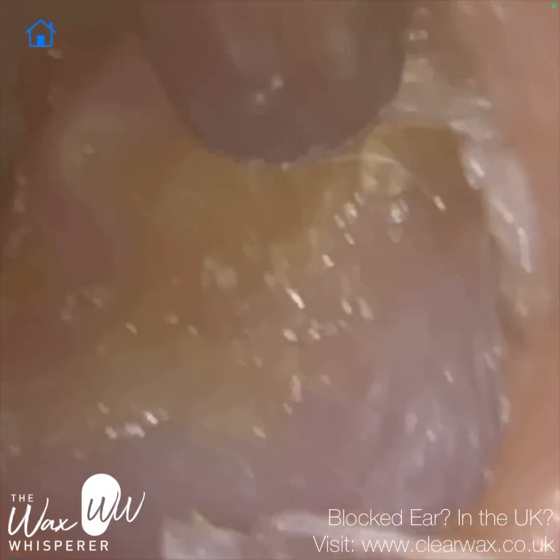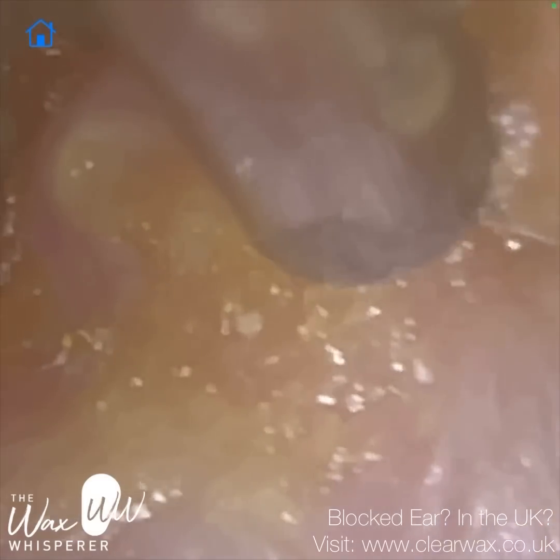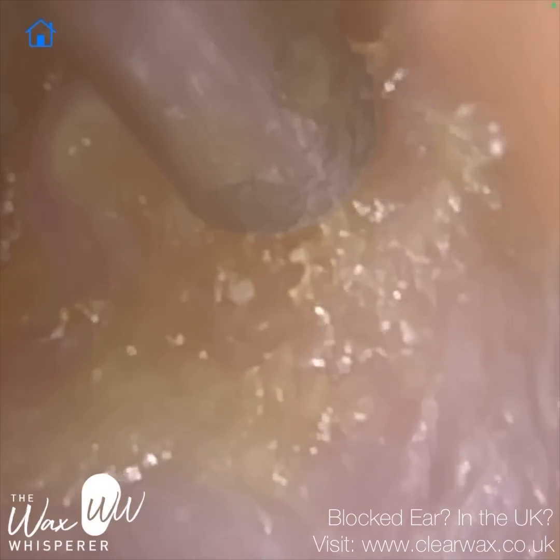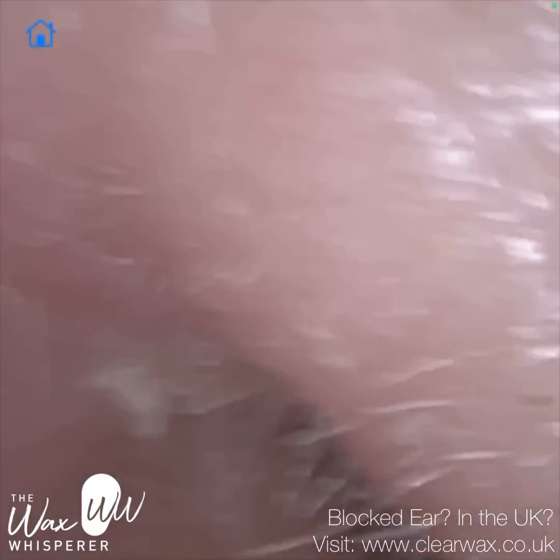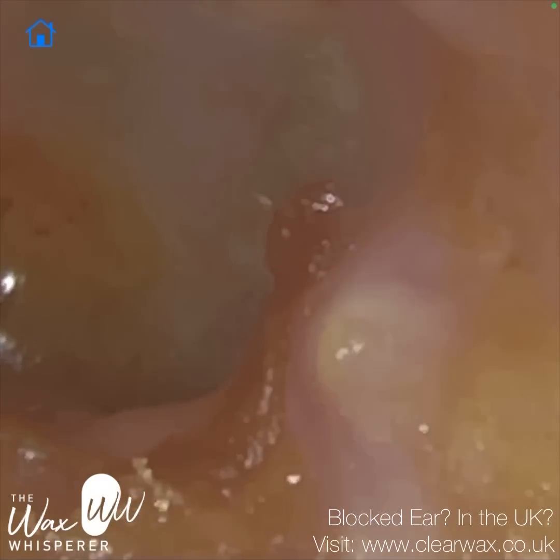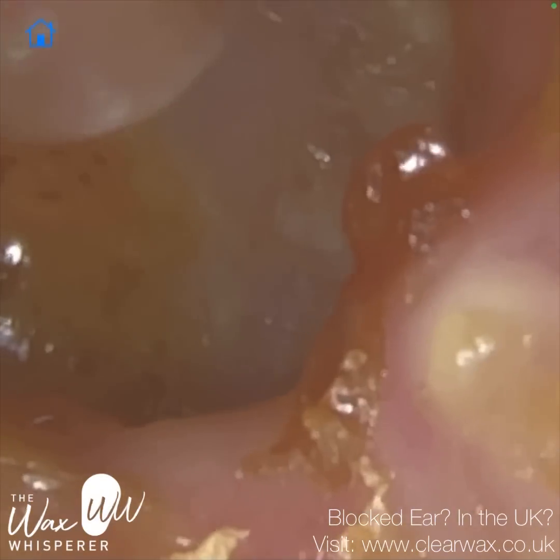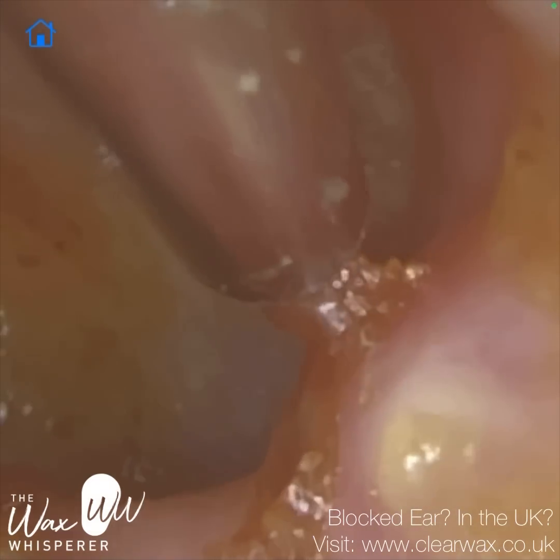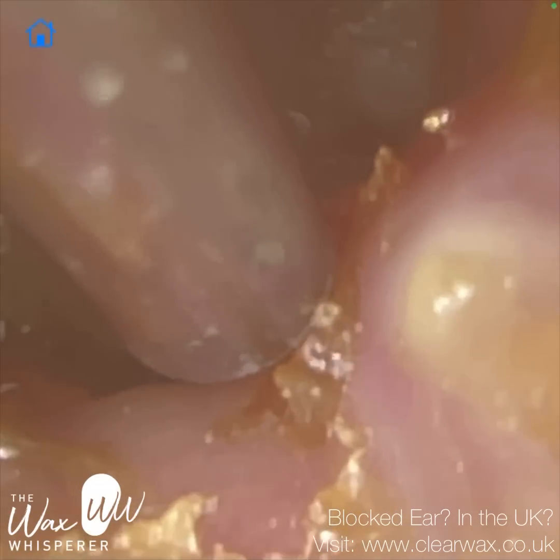We're just on the back part of the ear canal. This is the part of the ear that, if you make too much contact, the patient can elicit the gag reflex. We've got the branch of the vagus nerve called Arnold's nerve, and it's kind of the back posterior portion of the ear canal that you can stimulate on contact. As audiologists, we take impressions of the ears for various products — ear defenders, sleep plugs, swim plugs. That involves inserting what we call an otoblock, which is either a cotton wool or foam block, positioned inside the ear canal to prevent the impression material from going too deep. When we put that otoblock in, it can compress against the side of the ear canal and elicit the gag reflex.